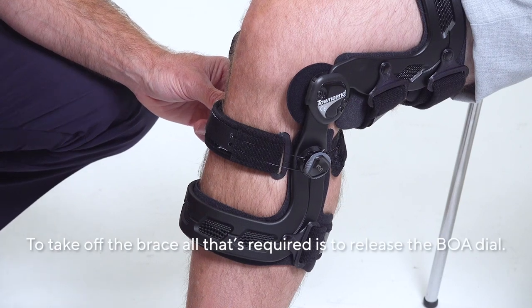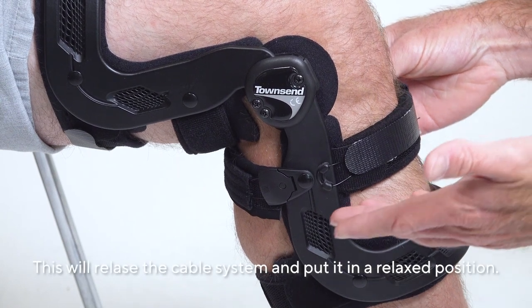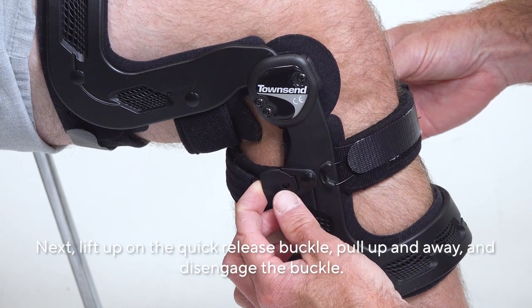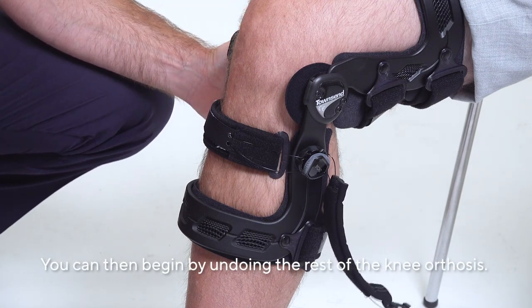To take off the brace, all that's required is to release the BOA dial. This will release the cable system and put it in a relaxed position. Next, lift up on the quick release buckle, pull up and away, and disengage the buckle. You can then begin unvelcroing the rest of the knee orthosis.